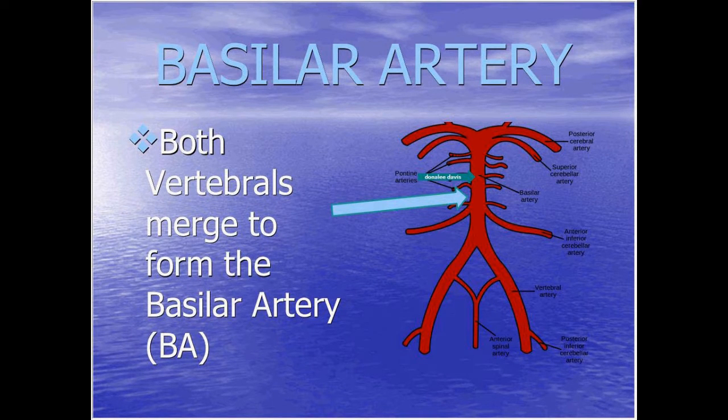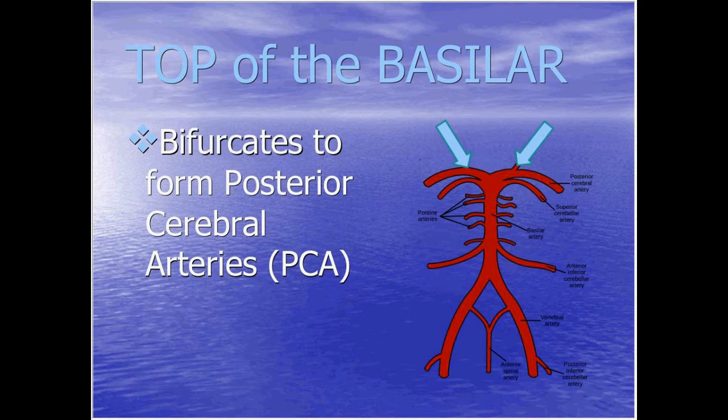Okay, so let's move on. Again, the top of the basilar, or the TOB, top of the basilar, is those posterior cerebral arteries. And this little tiny string sign right there, that's your PCOM, okay? That's your posterior communicating artery.